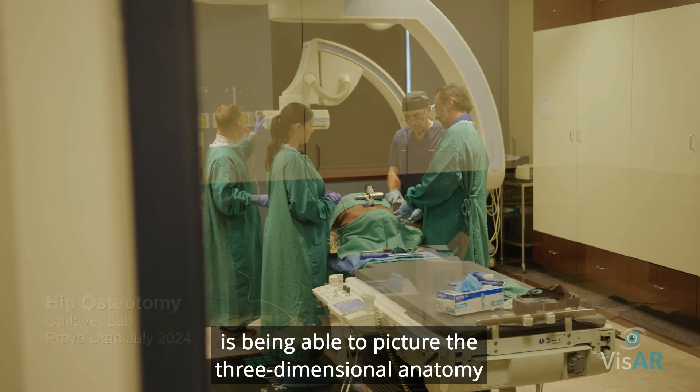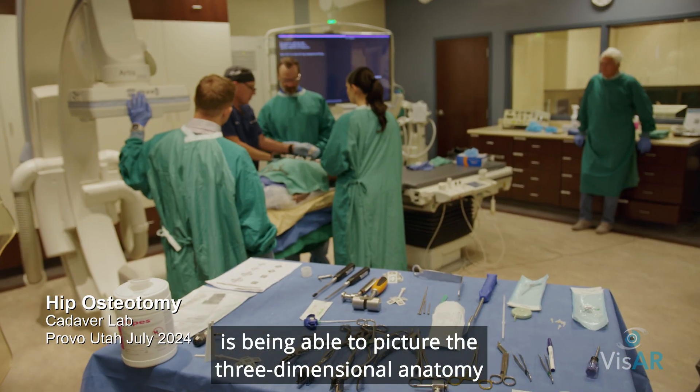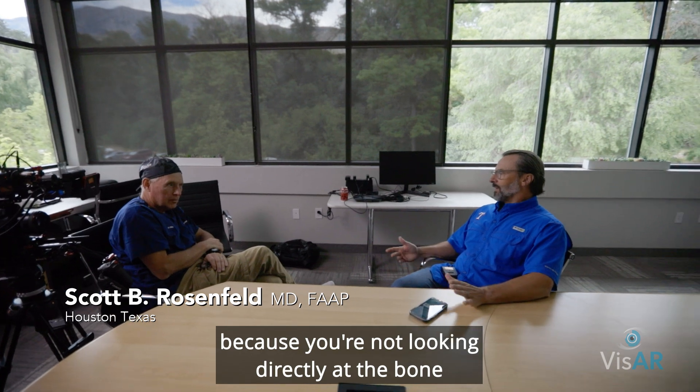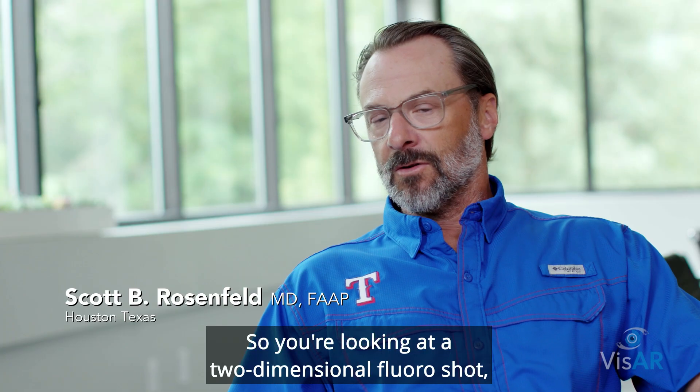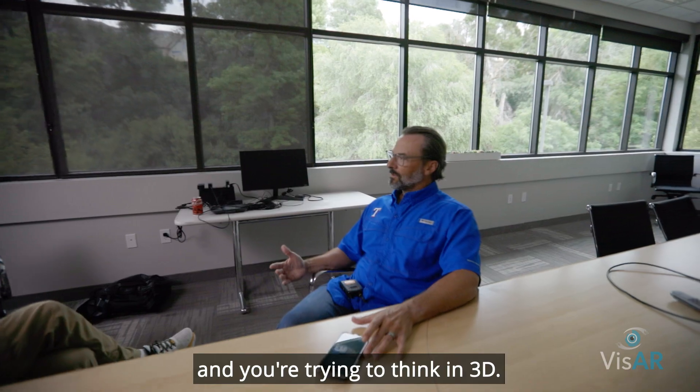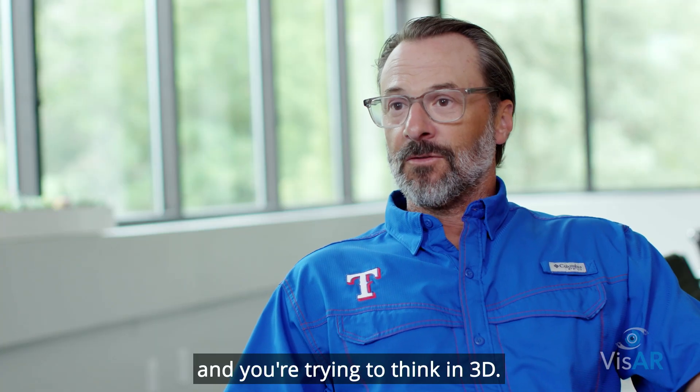One of the hardest things about a PAO surgery is being able to picture the three-dimensional anatomy in your mind while you're doing the surgery, because you're not looking directly at the bone you're cutting. You're looking at a two-dimensional fluoro shot and you're trying to think in 3D.